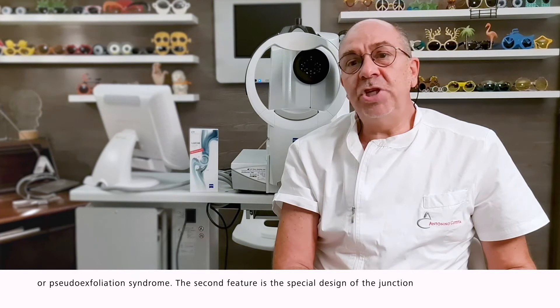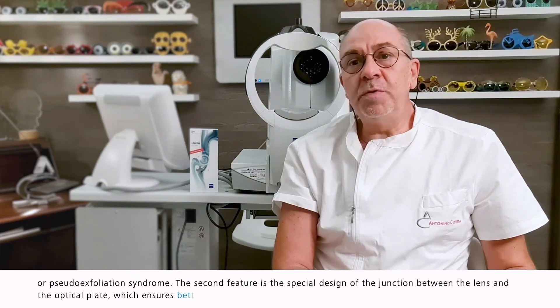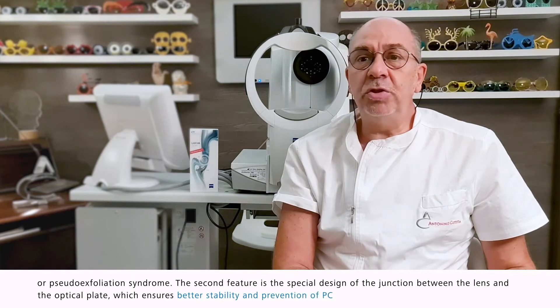The second feature is the special design of the junction between the lens and the optical plate, which ensures better stability and prevention of PCO.